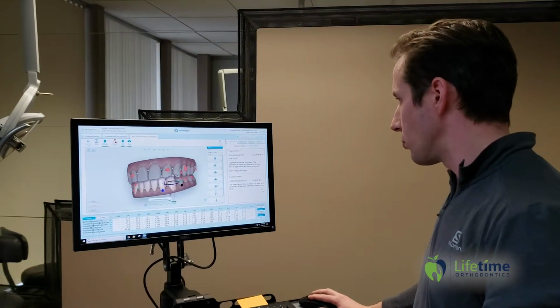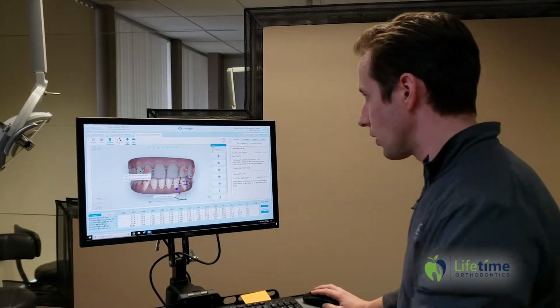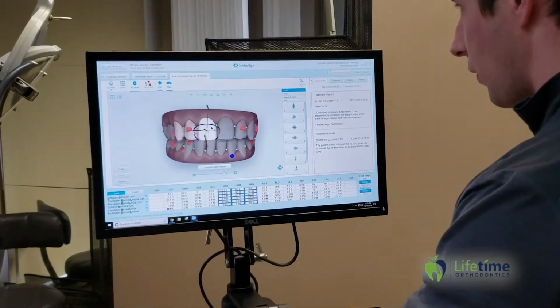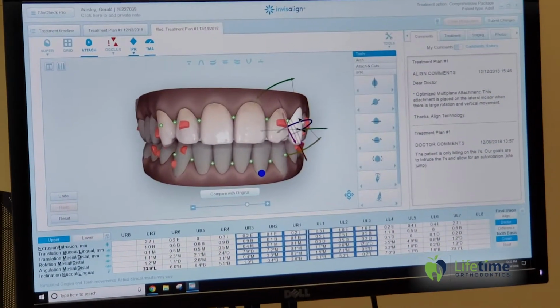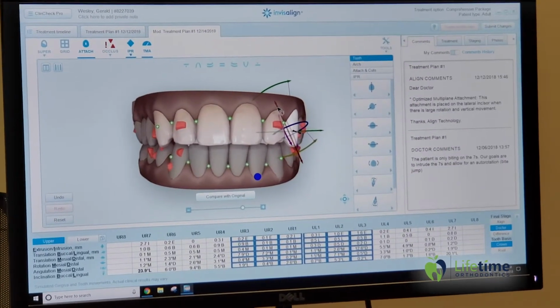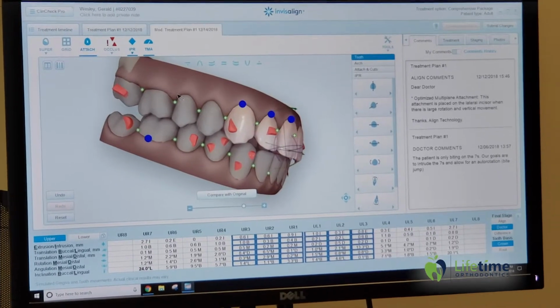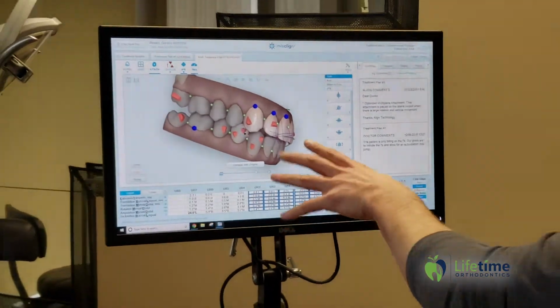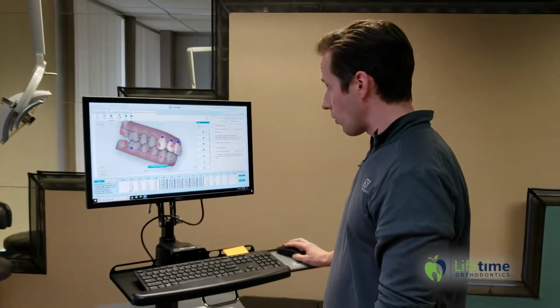This is a pretty good starting point. I'm going to be critical. I think these upper teeth can also move up a little bit, but this is something that we're going to refine a little bit in the second set of alignment. Okay, so we'll go up just a little bit here. All right, and then so I'm going to get this plan back, and there's no way it's going to be done correctly, and so I'm going to have to come back and I'm going to do a lot more adding attachments, assessing each tooth movement, and seeing how all the movements work.